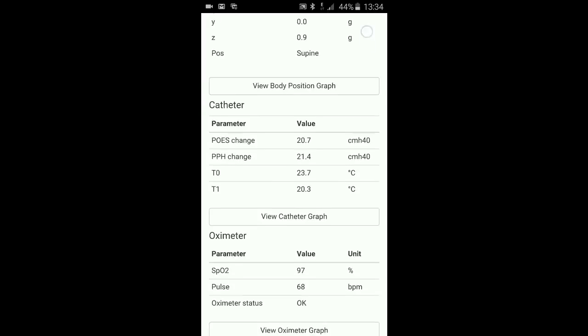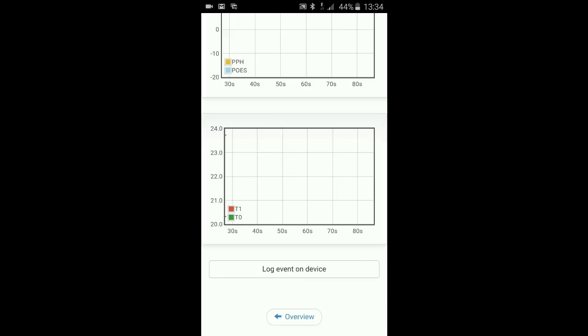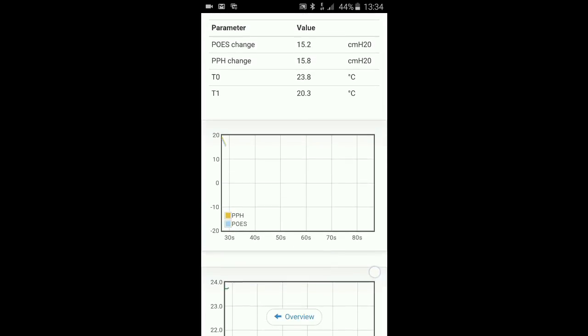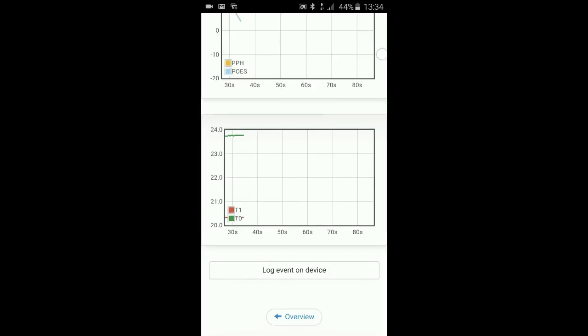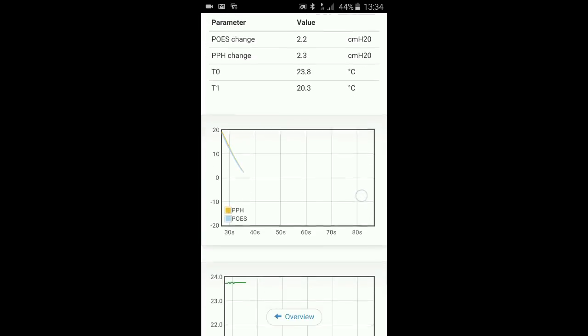I can look at the catheters. Graphical representation of the catheter values. It takes a while to tune in because of the internal filter in the app. Temperature at the bottom, pressure at the top. Come back to the overview.